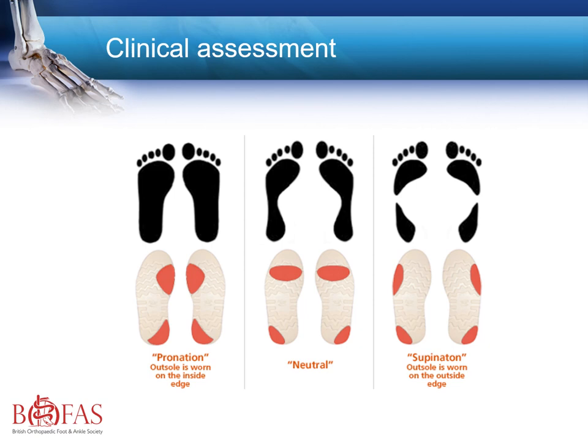piece of paper. You can see in the center area the bean shape of a normal plantar pressure, whereas on the left side there is increased medial pressure from overpronation, from the falling of the medial arch, whereas on the outside there's minimal medial pressure because of extra supination and a very high arch.